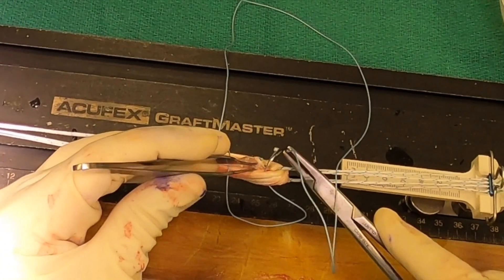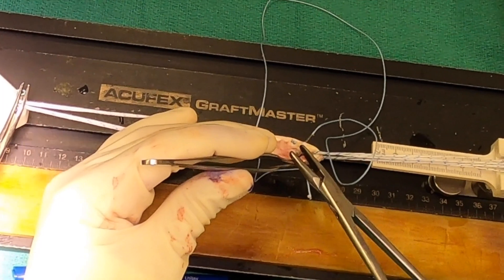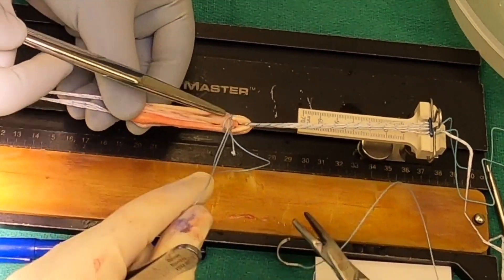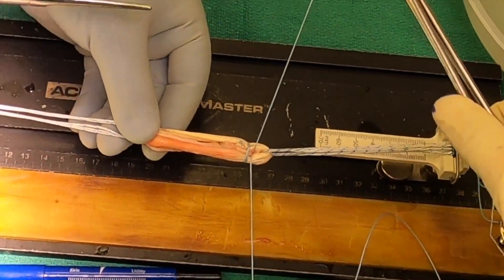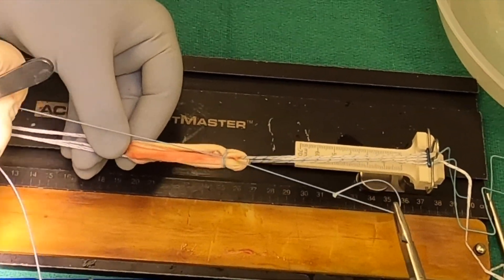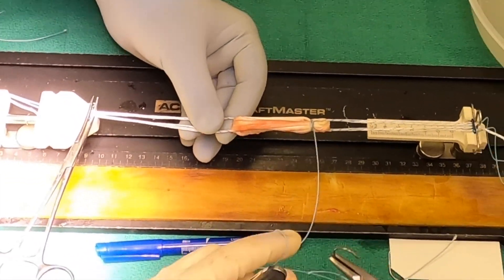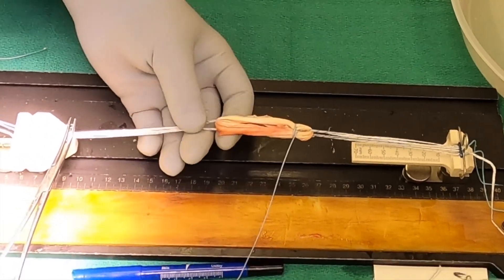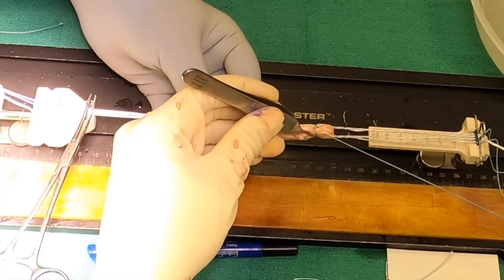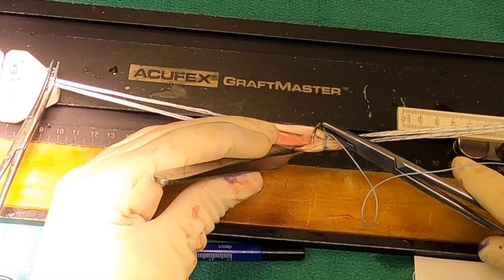Go through the outer one, then retrieve what will be the inner one, go through that, and come out the top again. Now we will tie this down — this will help to bundle it up and make it nice and snug. The other critical thing here is we don't want to put the suture through the loop from the endo button, so you've got to make sure you're clear of that because it'll bind it up when you're trying to pass your sutures. I'll take the other limb, pass it back through the graft before cutting it, just to make sure we bury that knot in the center of the graft.